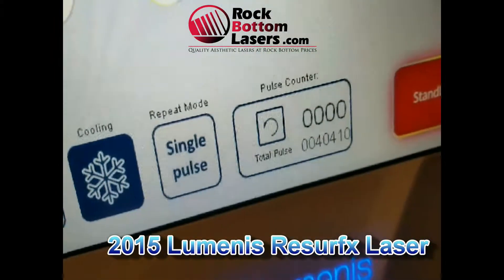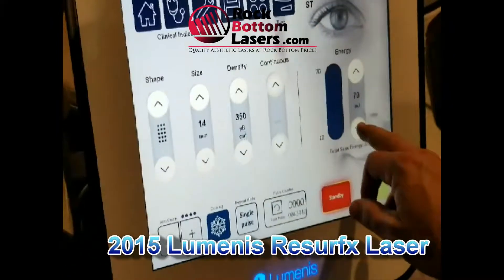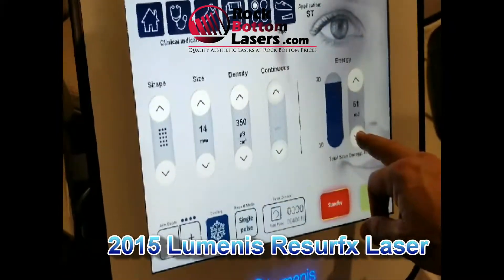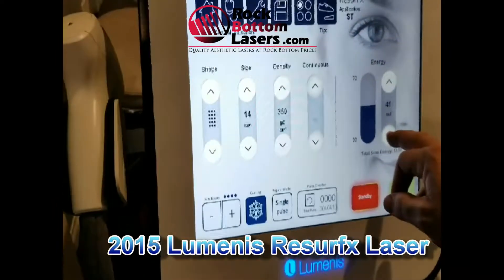Shot count is 40,410. We've got a Luminous Resurf X. We're just going to quickly — is there a foot pedal here or is there just a trigger? That's the question.